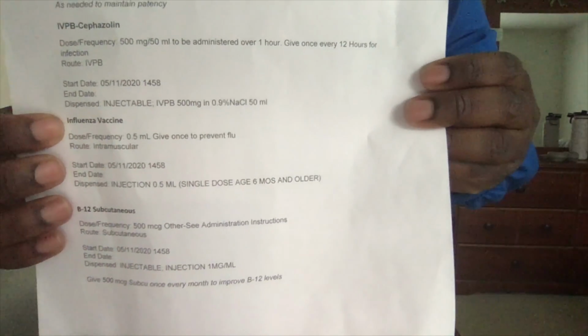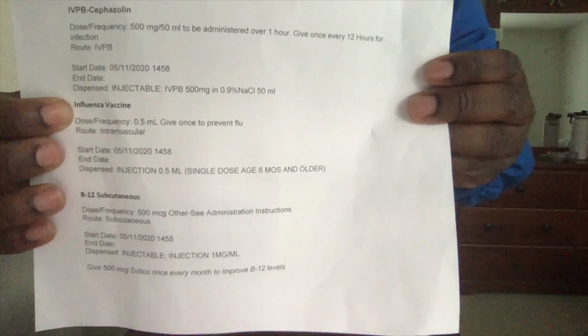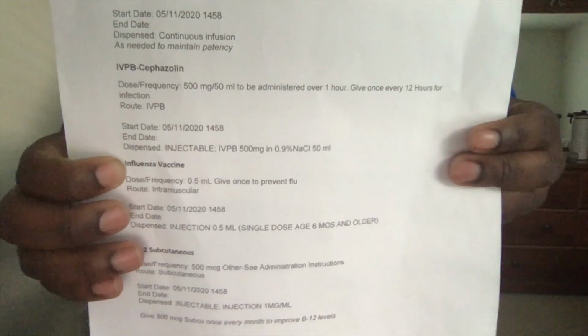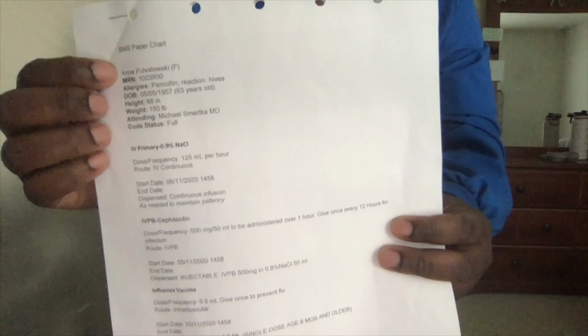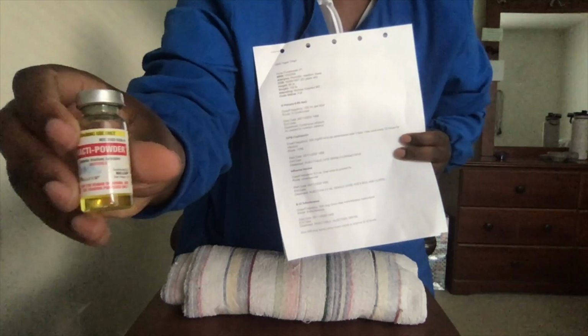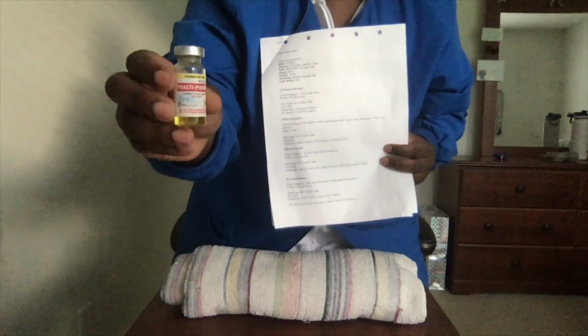At this point, I would compare the information that I see on the MAR to the physician's orders to make sure that they're correct. And since they're the same, I can go ahead and pull the medication and do my first set of 6 rights between the MAR and the medication label. This is Anna's chart. This says influenza, which it says here. This needs to be given as a vaccine, and this is possible because this is a vial.